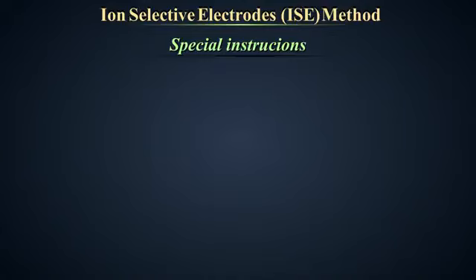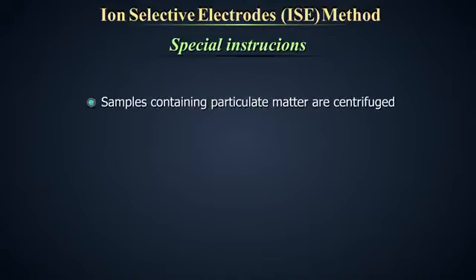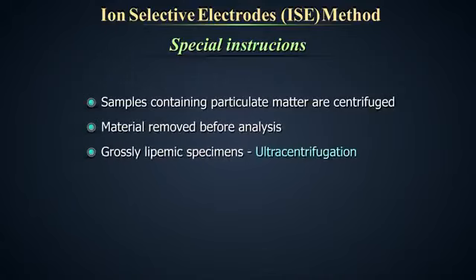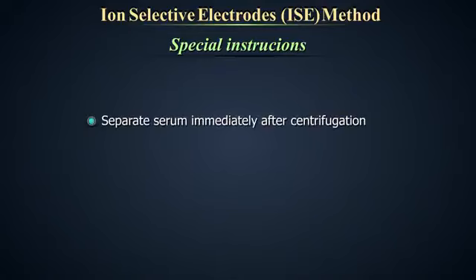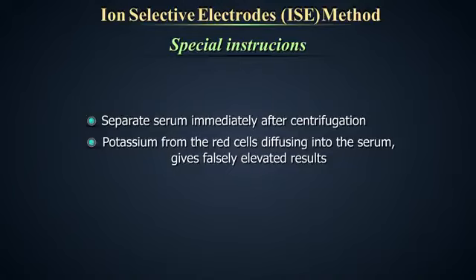Some special instructions. Samples containing particulate matter should be centrifuged and the material removed before analysis. Grossly lipemic specimens should be cleared by ultracentrifugation. Pseudohyponatremia may be seen with lipemic specimens as a result of fluid displacement. Separate serum immediately after centrifugation. Potassium from the red cells will diffuse into the serum, giving falsely elevated results.